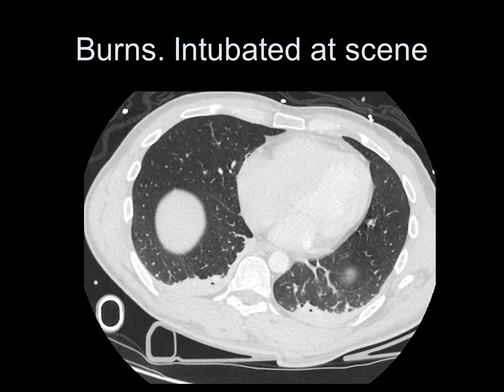This patient sustained serious burns and had to be intubated at the scene. The patient has a pattern at the lung bases which is very similar to the last case. Was that opacification at the left base consolidation or atelectasis? I think this is atelectasis — it's a bilateral symmetrical process, there's no history of trauma, no evidence of pneumonia, and no reason to think pulmonary contusion. So we should call this bibasal atelectasis, not consolidation and not contusions.